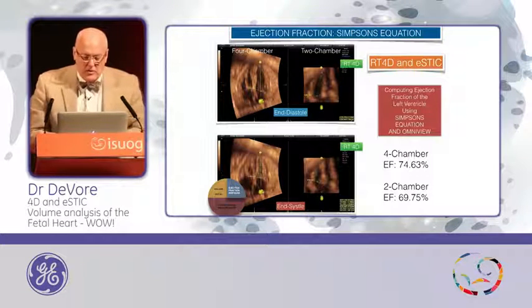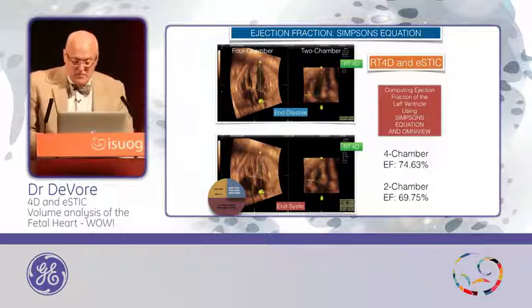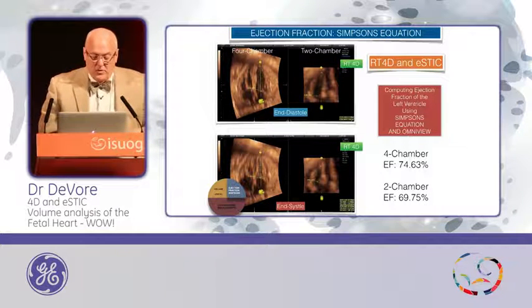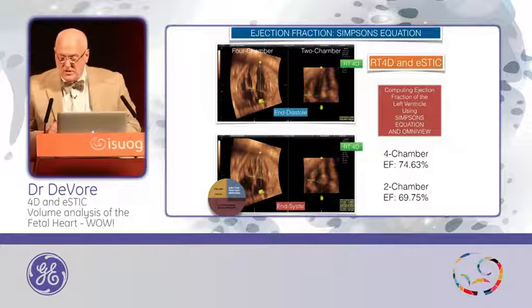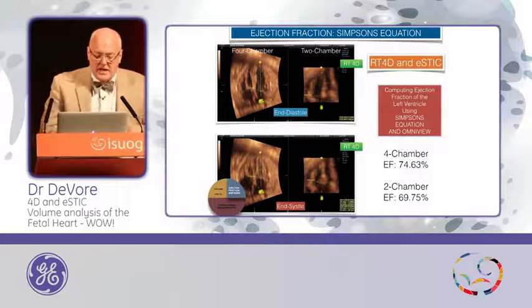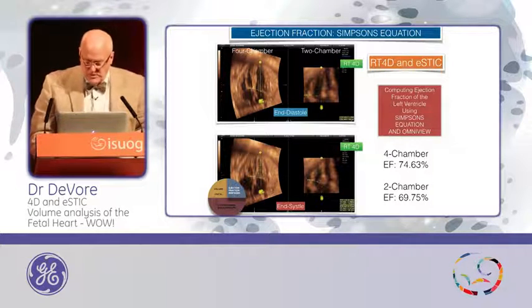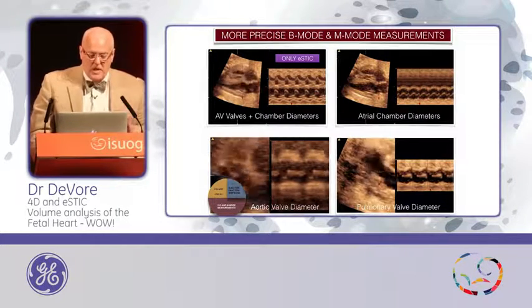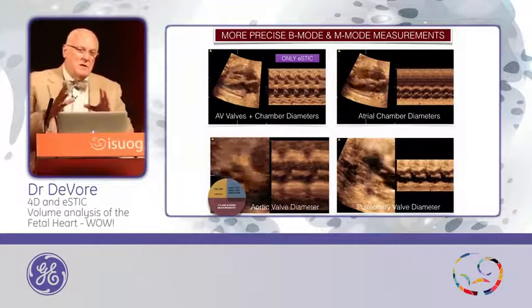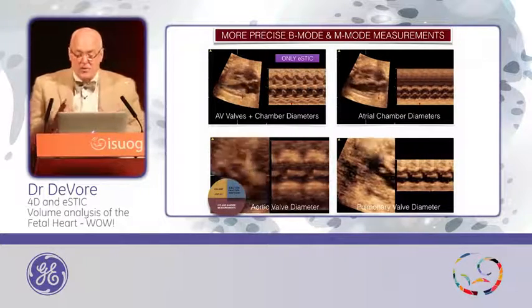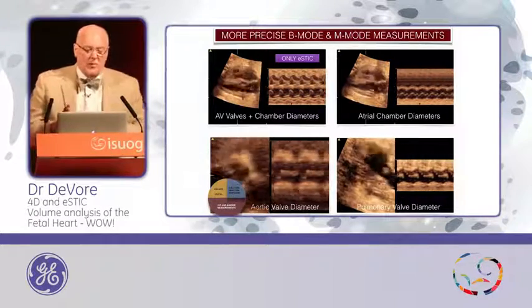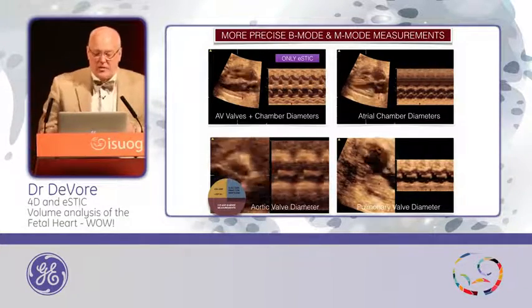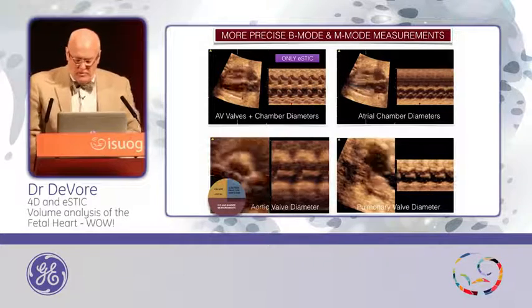Using OmniView, we can draw a line down the left ventricular chamber to see the two-chamber view, and the software has Simpson's Rule, allowing us to trace the ventricles and compute ejection fraction in a much more precise fashion. Using E-STIC with M-mode, I have the ability to display the M-mode on the right, and for measurement purposes you're going to be much more accurate determining end-diastolic and end-systolic values for the various chambers.